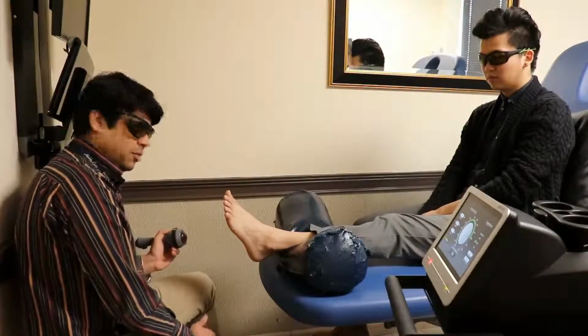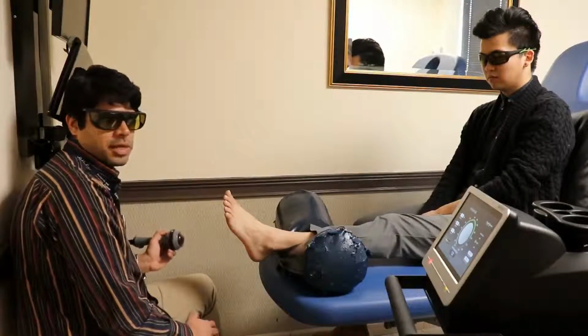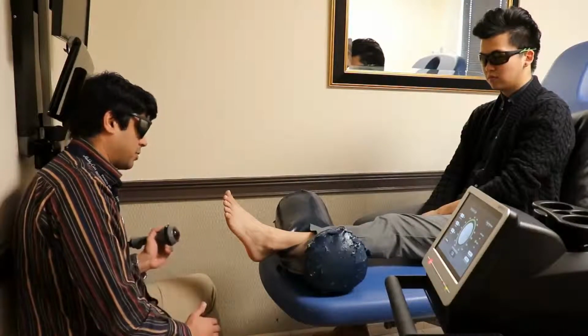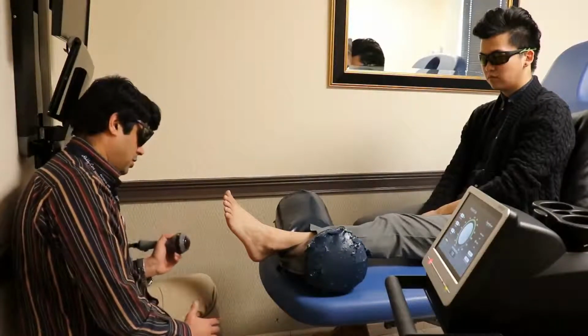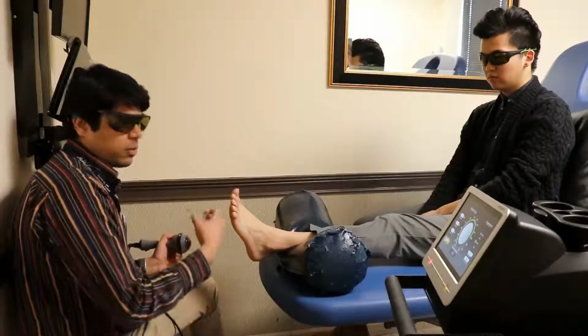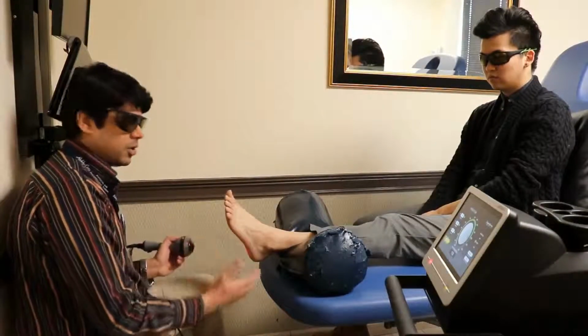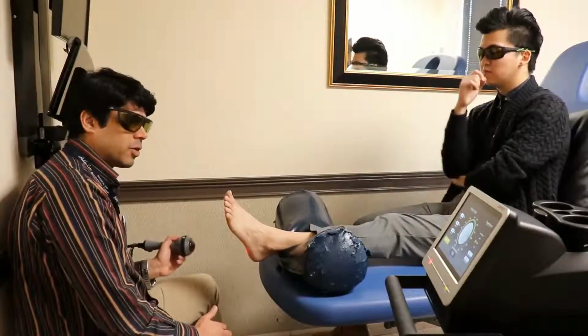So we've been doing this with Anthony for 3.5 minutes now. When I started, it was rather close to his skin, almost in contact with the skin. It's been getting a little hot, so I've been moving it further away from him. This whole treatment mechanism is basically directed at patient comfort level. It's not something we're going to force in terms of how hot it should or should not be. As long as you are comfortable with what we're doing, that's what we're primarily looking at.